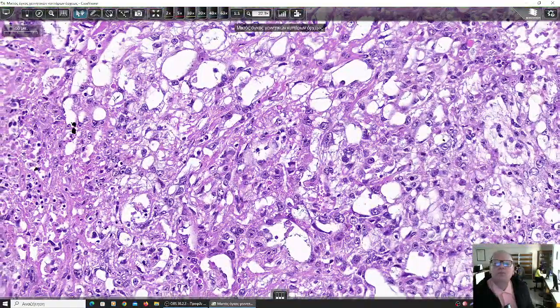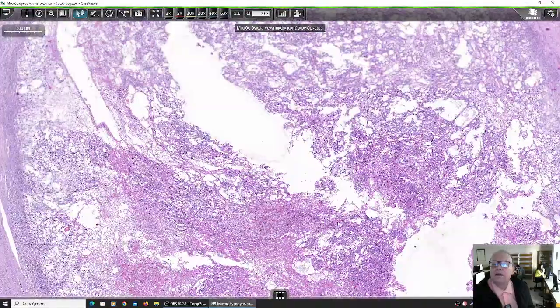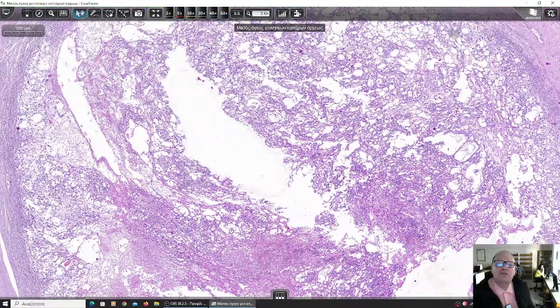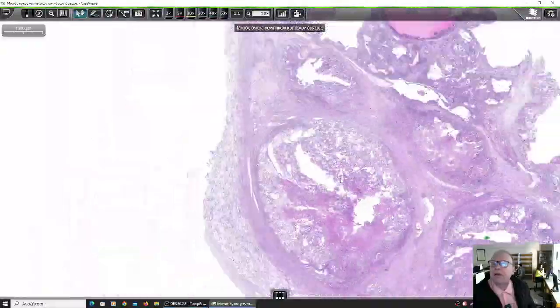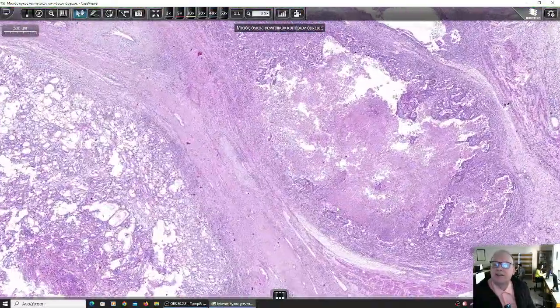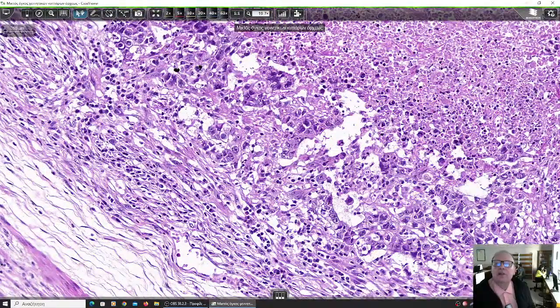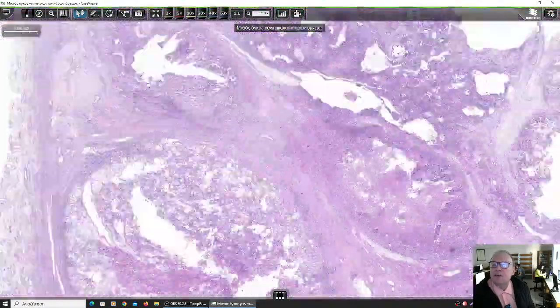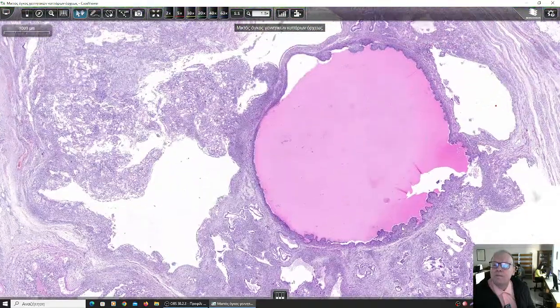So, rarely are these tumors the only tumor. They most often coexist in the adults, and they are always malignant. For example, this could be an embryonal carcinoma coexisting with the yolk sac tumor, and this could be a teratoma.